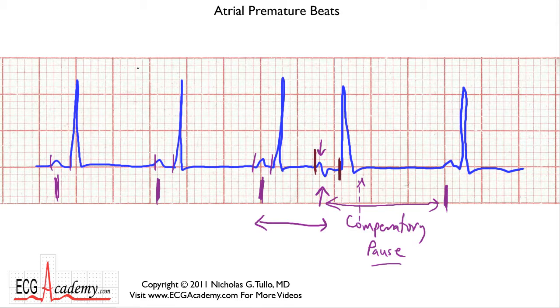And you'll often see that because if you recall, the AV node, which receives signals from the atrium and passes it down to the bundle branches, behaves in such a way that an early beat or rapid beats may not be able to pass down the AV node quite so easily, and you may get excessive AV delay with a premature atrial beat. You can even see first-degree AV block with some PACs, and if this beat occurs early enough, it may not even be able to get through the AV node at all. We'll cover that in the last video in this section.